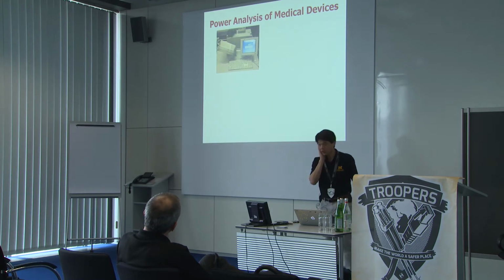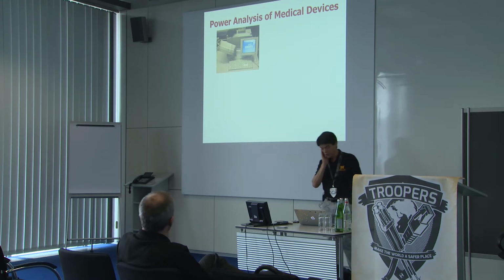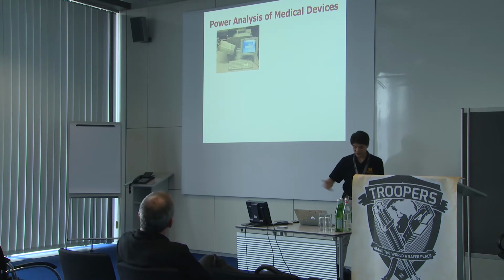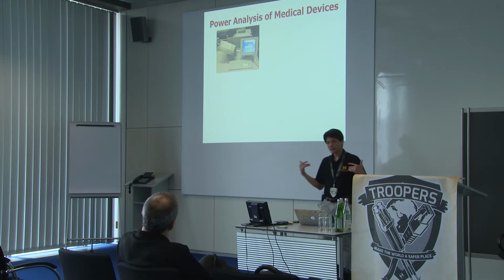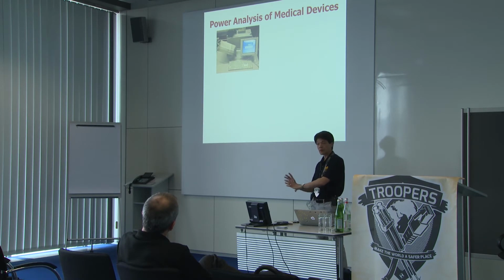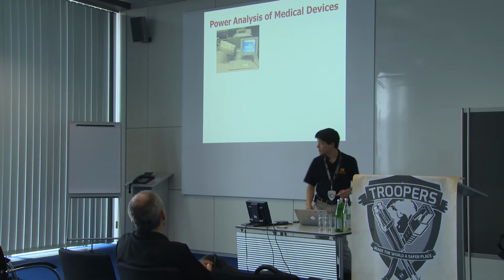I did briefly want to talk about a couple of approaches to improving security. So I'll talk about just one of them coming out of the research lab. This is a system a couple of my students built over the last few years. It's called WattsUpDoc. What we basically do is we measure power consumption at the power outlet. And from the power consumption patterns, we can tell if your device is infected with malware with extremely high accuracy, precision and recall.